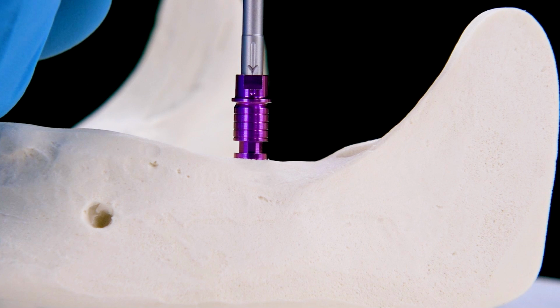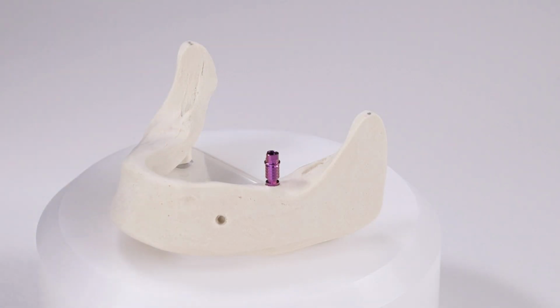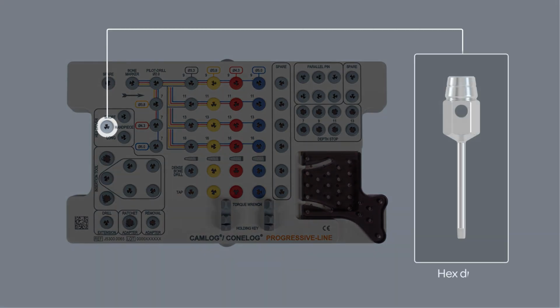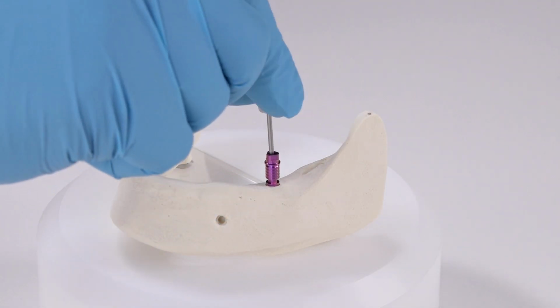After successful checking of the implantation depth as well as the position of the grooves, the insertion post can be separated from the implant. After removing the insertion tool, loosen the screw inside the insertion post with the screwdriver hex and remove the insertion post with the forceps or by hand.